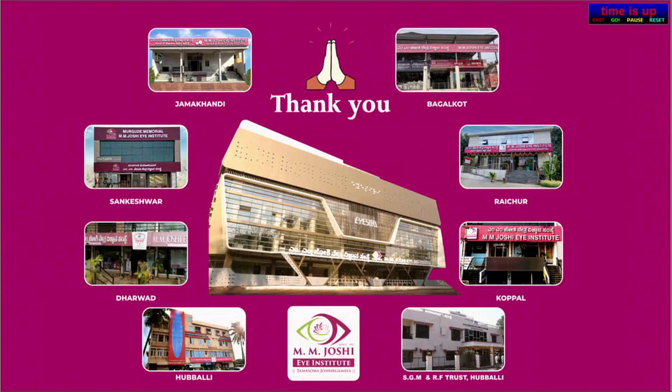So I was just coming to that. Wonderful presentation. You could have shown a video also of the surgery anyway. But the comparison with other sutureless SFIOLs is very important. Yes, sir. And one more thing about the CMT flex is that it involves less manipulation of the tissues and it is sutureless, so the suture-related complications are less. It is a surgery where the learning curve is very short. That is why, compared to the other study, the CMT flex IOL has a better profile.